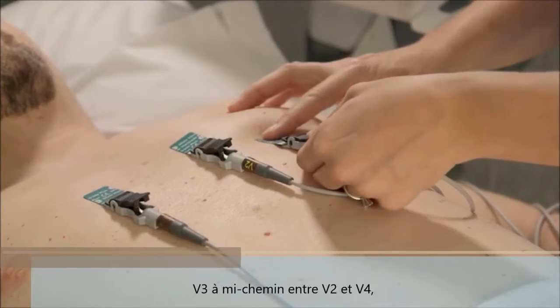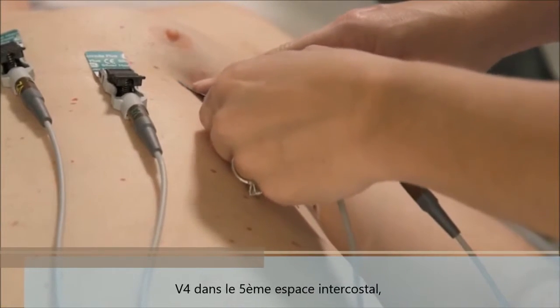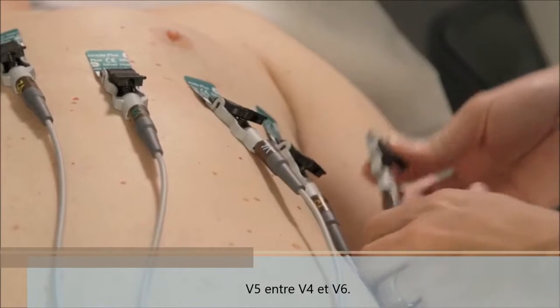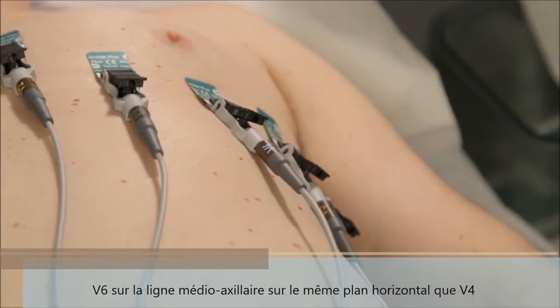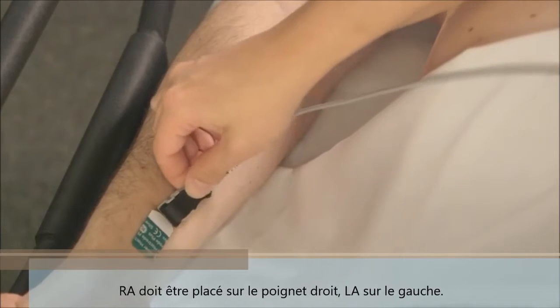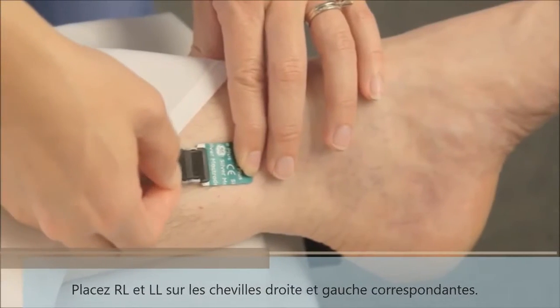Place V3 midway between locations V2 and V4. Place V4 at the mid-clavicular line at the fifth intercostal space. V5 between V4 and V6 on the same horizontal line. V6 at the mid-axillary line on the same horizontal level as V4. Right arm needs to be placed on the right wrist, left arm on the left. Place right leg and left leg on the corresponding right and left ankles.